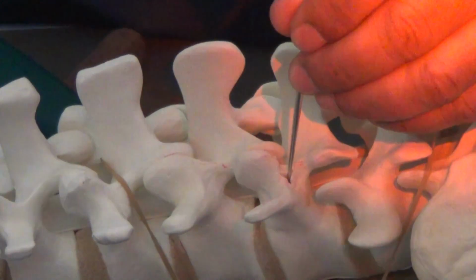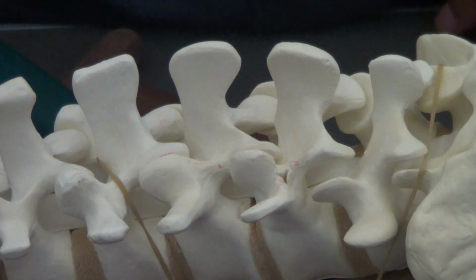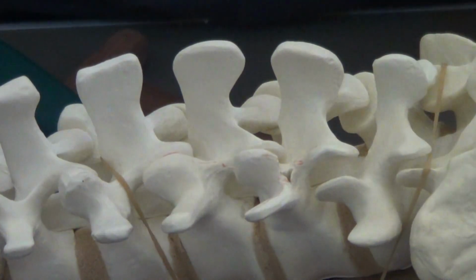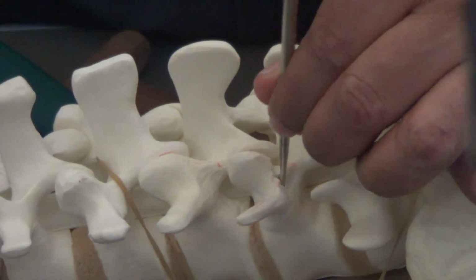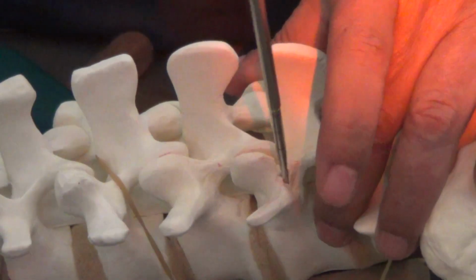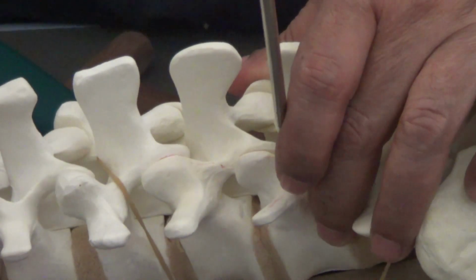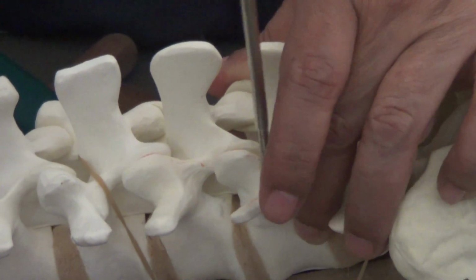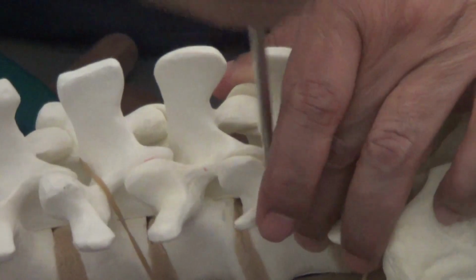So once you're inside, then you take your awl. No, not that awl. This probe. Yeah, probe. So you go in, and again the same direction, 10 degrees angle here. This is L4, and slightly caudal, 10 to 15 degrees. Actually, the best way to judge it, often you don't remember it, is we have the lateral view in front of you. You can see what exactly is your angle there. So you go in about 20 millimeters, and then you would have crossed the pedicle by then.